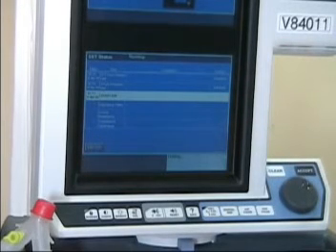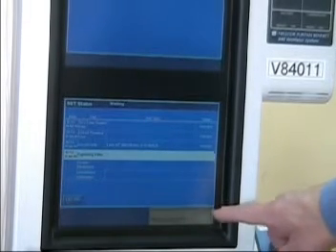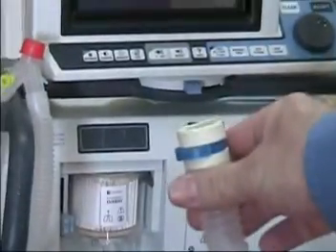It's going to check for circuit leaks. Up on the top screen we can see it's actually measuring for leaks. It's passed that test, and now it says disconnect from patient port. So we're going to disconnect this and remove the tubing. Now we will press the accept button.